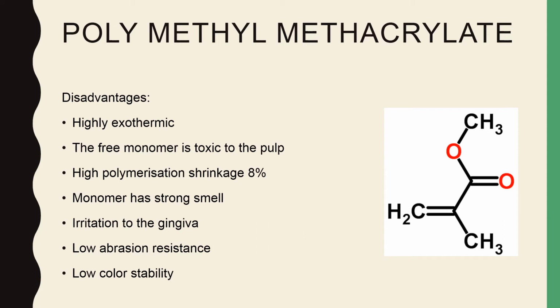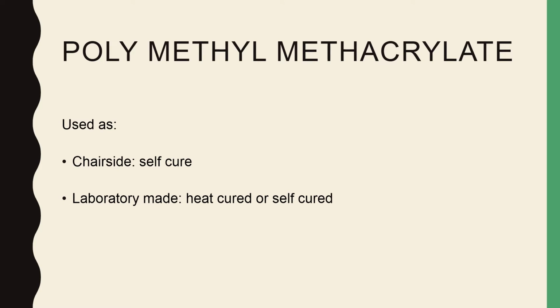color stability. The polymethyl methacrylate could be used to fabricate provisional restorations, either chairside, and it comes as self-cured, or laboratory made, which is available as heat-cured or self-cured. And in strength and color stability, the heat-cured is better than the self-cured one.